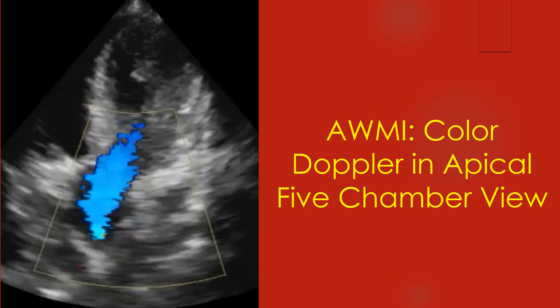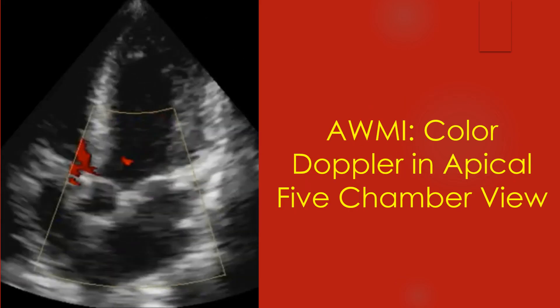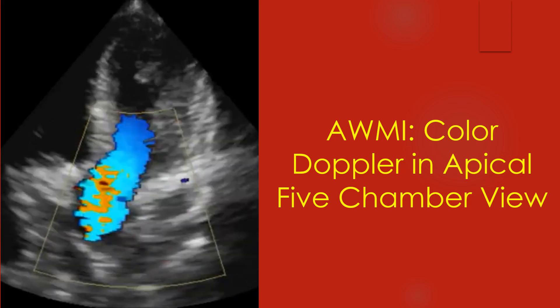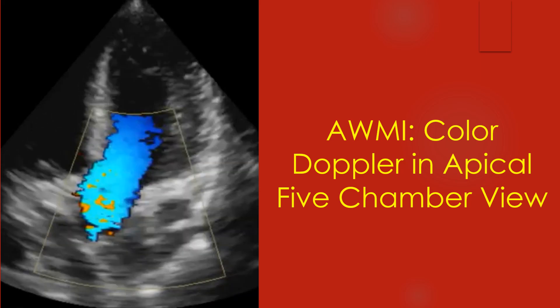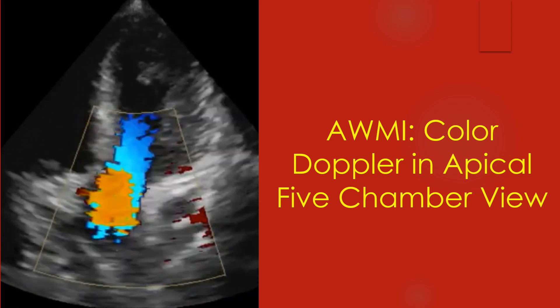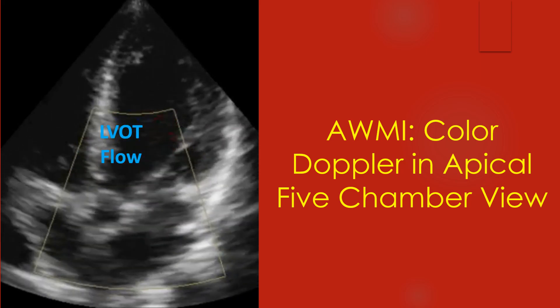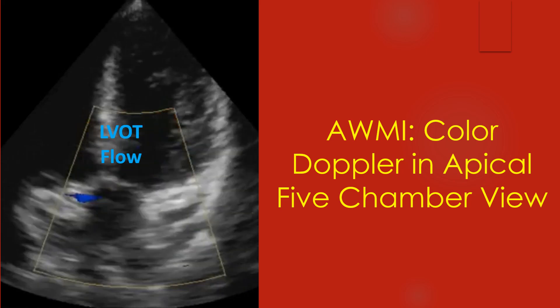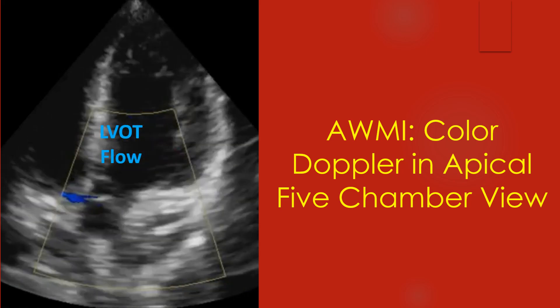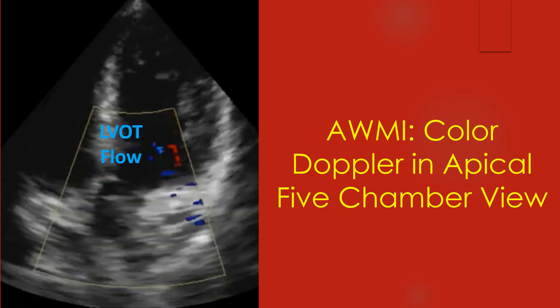Apical five chamber view with color Doppler imaging shows the aorta and aortic valve in addition to the four cardiac chambers. Blue flow away from the transducer is seen in the left ventricular outflow tract and proximal aorta.